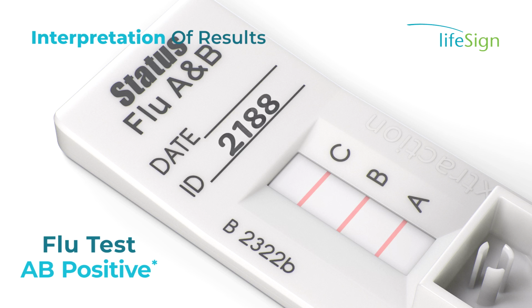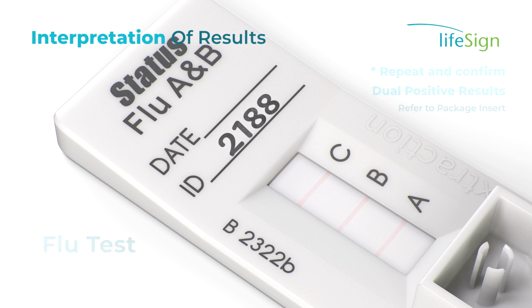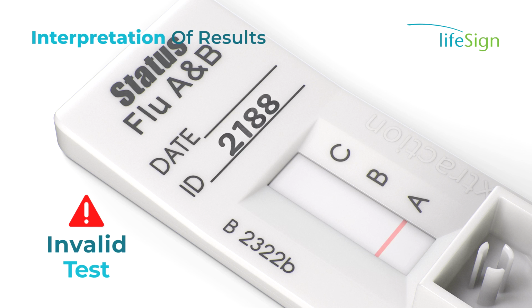Co-infection with influenza A and B is rare and should be retested. Repeatable dual positive results should be confirmed by PCR before reporting results. A reddish-purple line should always appear at the control line. If the control line does not form after 15 minutes, the test is considered invalid and should be repeated using a new Status influenza A and B test device and specimen.